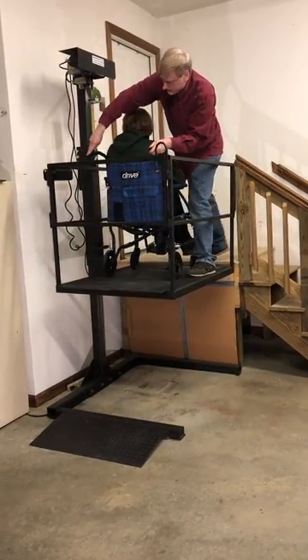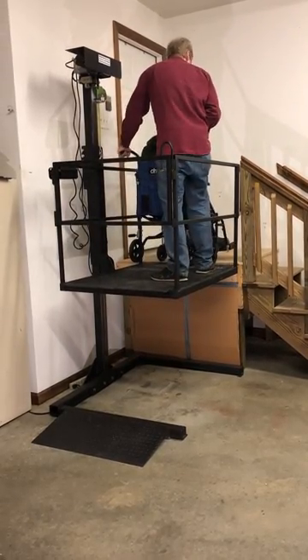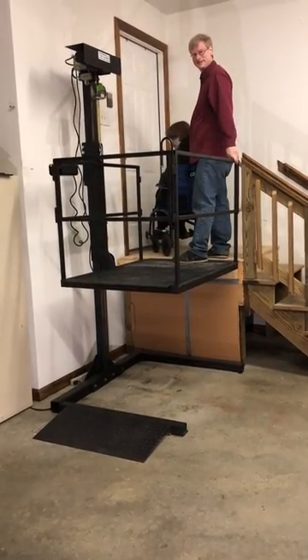And then you can come out and go into the house. Shut the door behind you, and that's it.